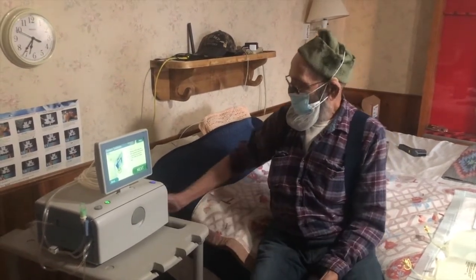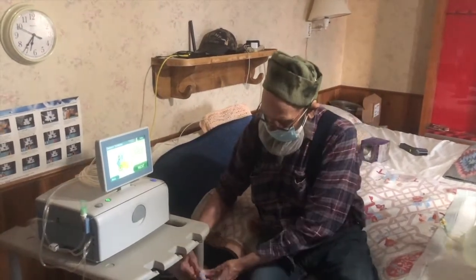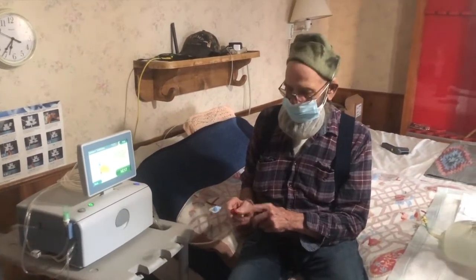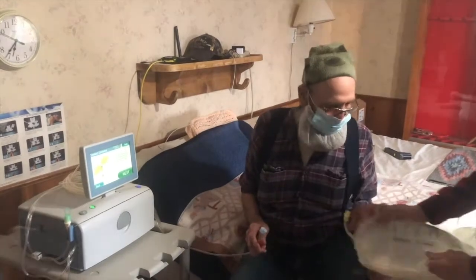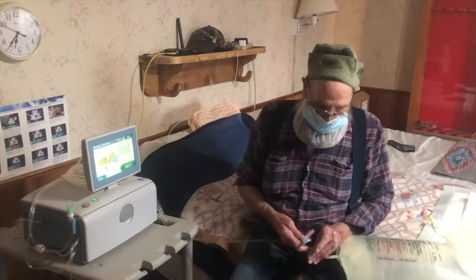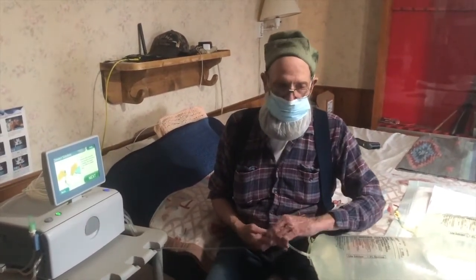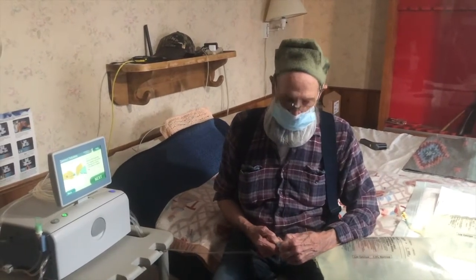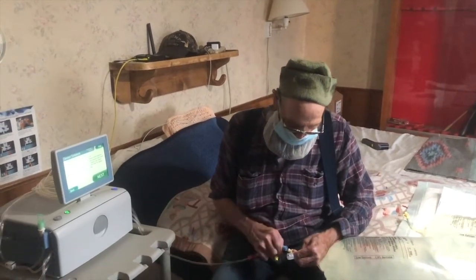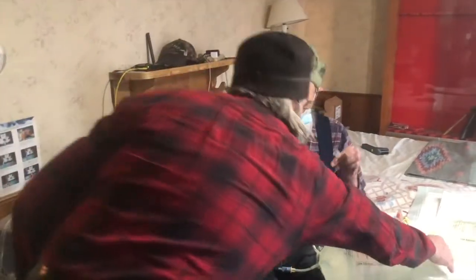Remove the red clamp line from the organizer and connect the first line on the prescribed solution bag. It's always got the red, that's always your first line coming in. That's the first bag. And this is where you want to do this as fast as you possibly can, and make sure that you don't stick your finger anywhere on it. So you open this thing up, get this out, pull that out, screw that together, and it's done.